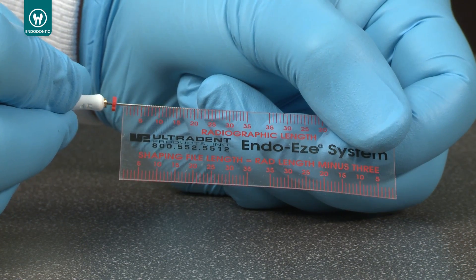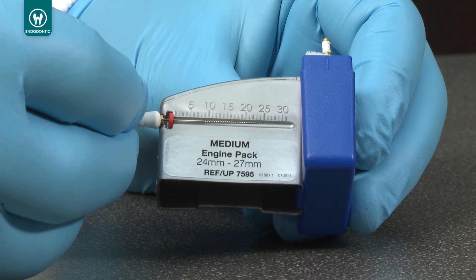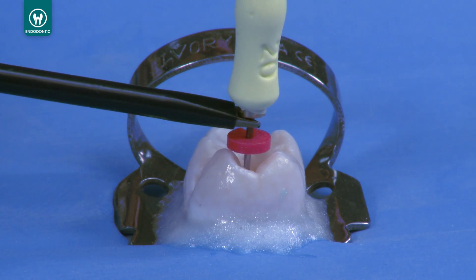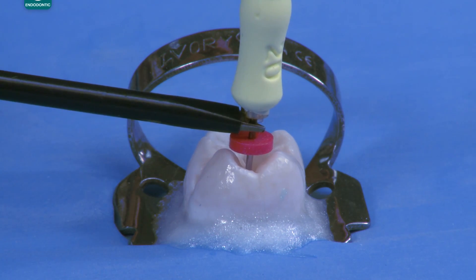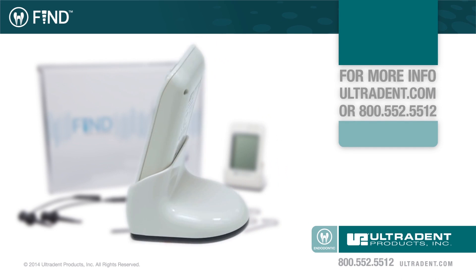Determine the working length using an endodontic ruler. To establish the working length, subtract 0.5 to 1 mm from the electronic length. The operator can check the position of the file at any time during instrumentation using the touch probe. Simply touch the probe to the file while the file is in the working length position. The EndoEase Find Apex Locator — simplifying endodontics.